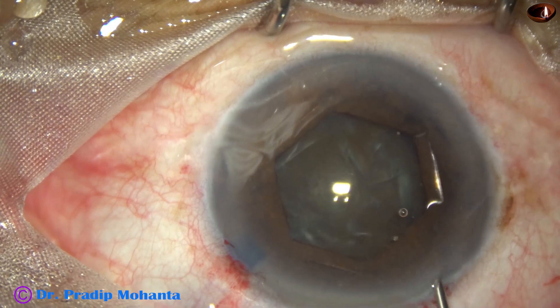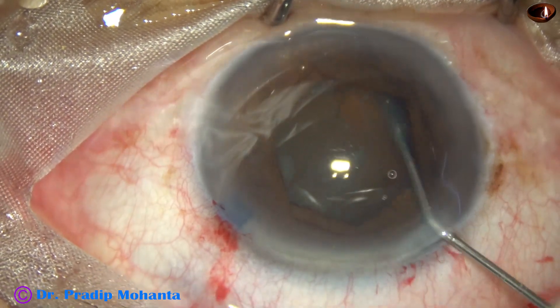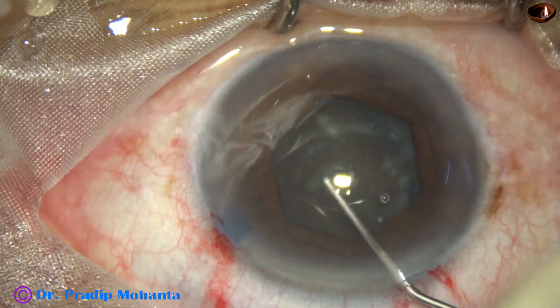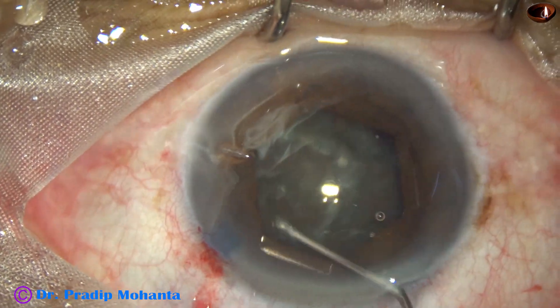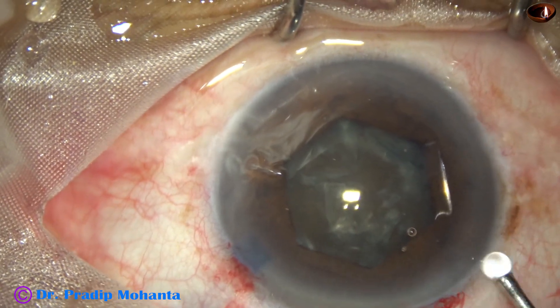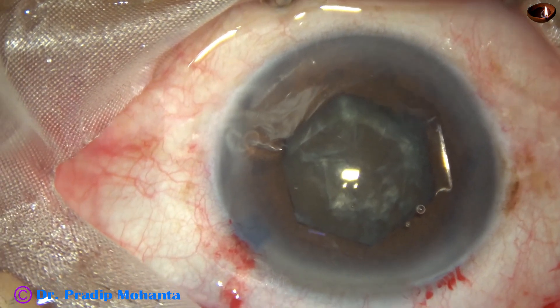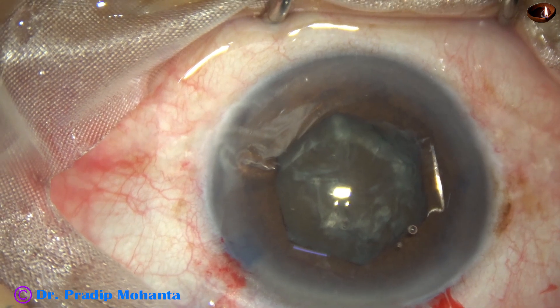Hydrodissection is done at multiple points. Small amounts of BSS are injected, the nucleus is nudged, and ultimately the nucleus rotates. Some viscoelastic is used to fill up the anterior chamber before introduction of the phaco needle.